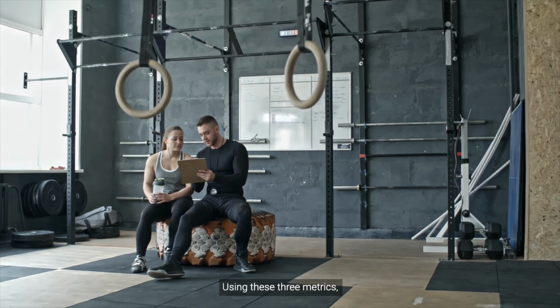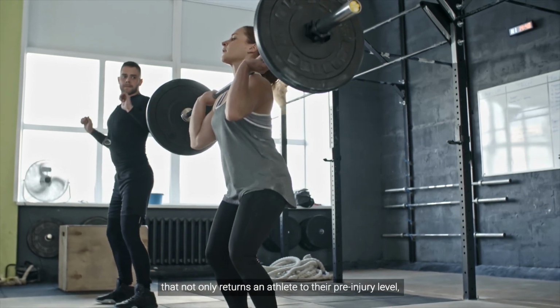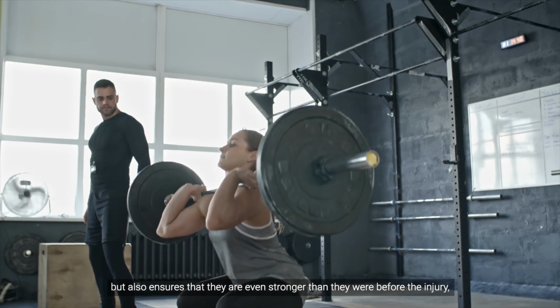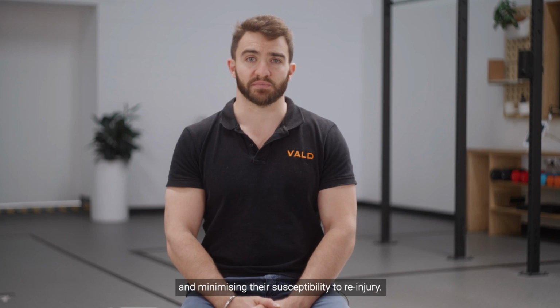Using these 3 metrics, a coach can help to devise a rehabilitation program that not only returns the athlete to their pre-injury level, but also ensures that they are even stronger than they were before the injury, thereby maximizing performance and minimizing their susceptibility to re-injury.